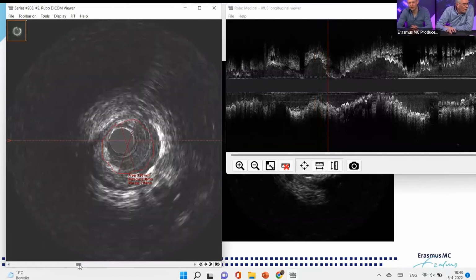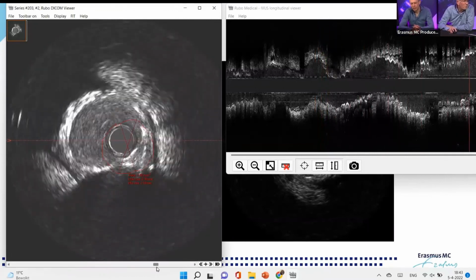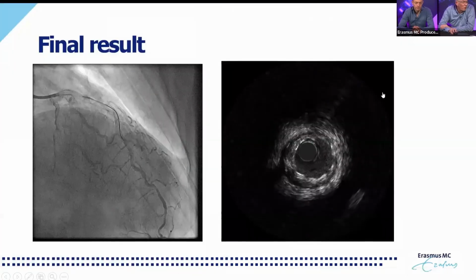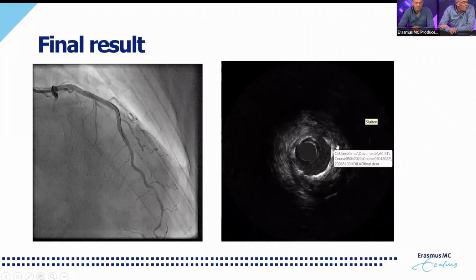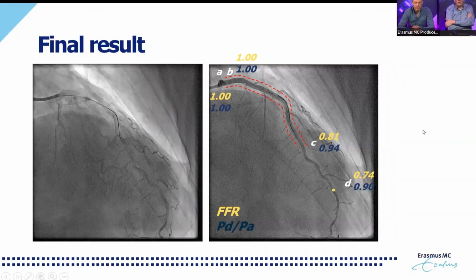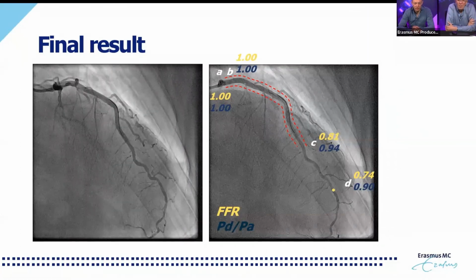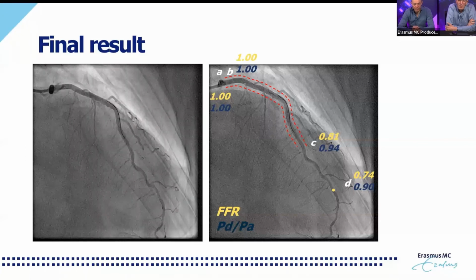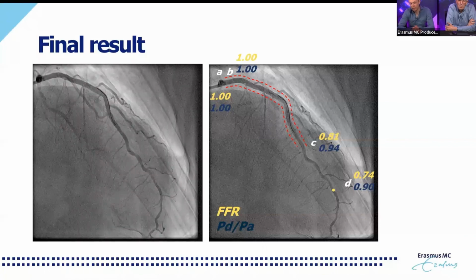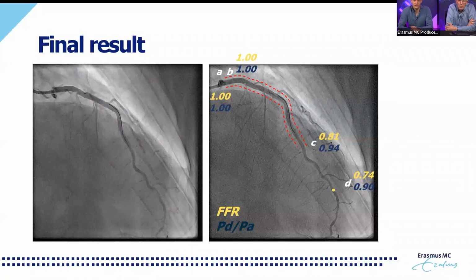So this is still significant underexpansion if you define expansion as minimal stent area divided by the distal reference area. We still would have somewhere around 60-70% expansion here, which is suboptimal. Now let's see if they found that also, but this was a final result. So that's when we repeated the physiological assessment and now measured an FFR of 0.74. So still a poor result. But please be aware of the fact that the Navvus catheter here was positioned probably a bit more distal than the initial position.